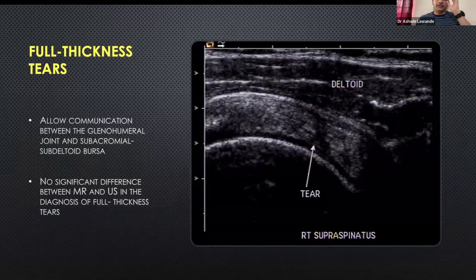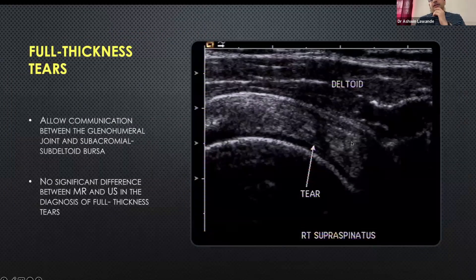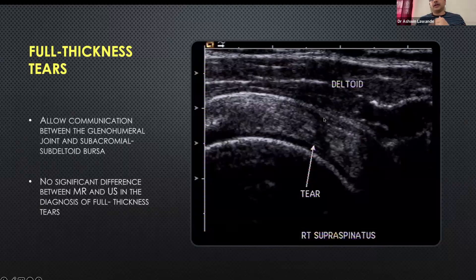Then we come to full thickness tears. The rotator cuff is like a barrier — a wall between the subdeltoid bursa and the glenohumeral recess. The moment there is a breach in that barrier, you see a cleft or a tear going from the bursal to the articular surface, and that is labeled as a full thickness tear.